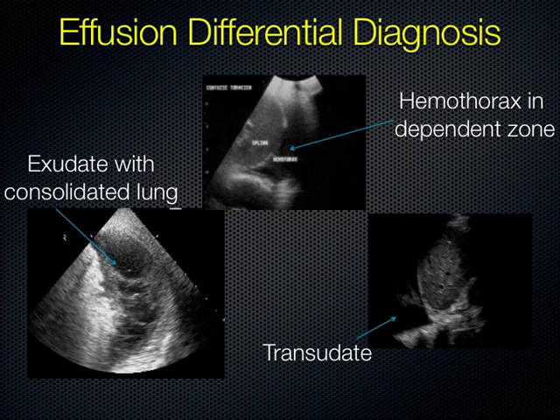But so it's very helpful for that. Notice on that bottom right image of the transudate, you can see the spine shadow behind that.